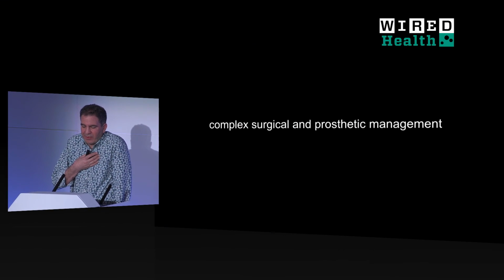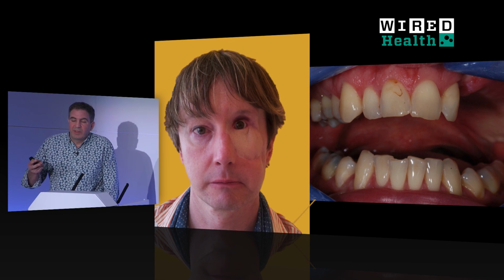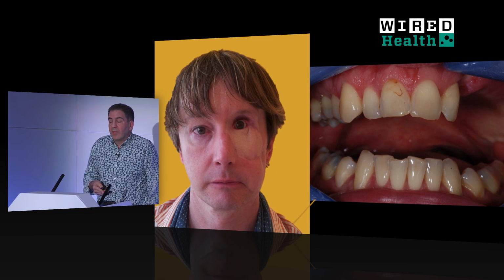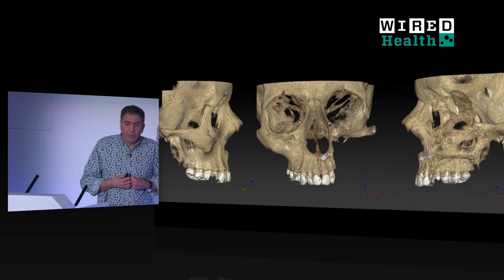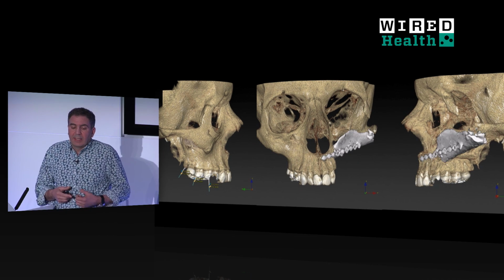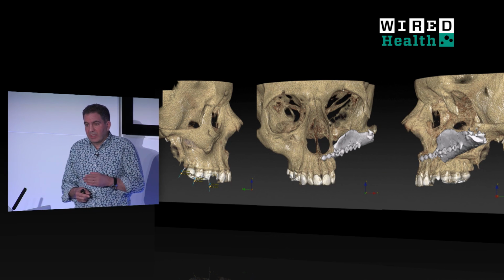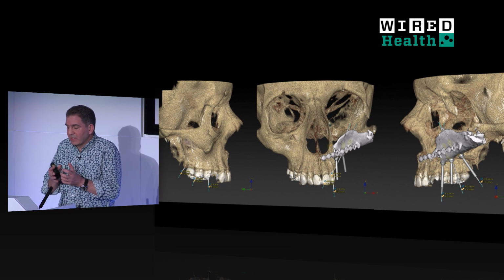So finally, a very important case, because Josh, the patient, has been brilliant enough to come along today to speak to us. Now, Josh suffered from a melanoma of his eye, which led to the loss of the left side of his jaw. And again, with so much missing structure, we had to look for a radical surgical solution. And this was what we achieved with a graft of bone taken from the scapula, that surgery carried out by Professor Ian Hutchison. And I placed dental implants into this graft.